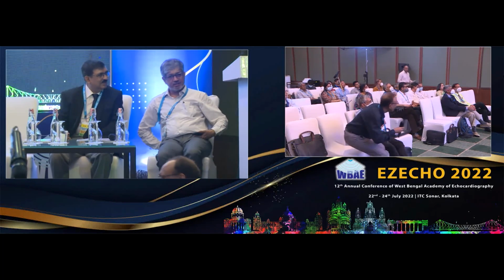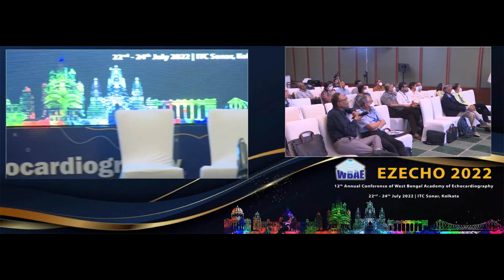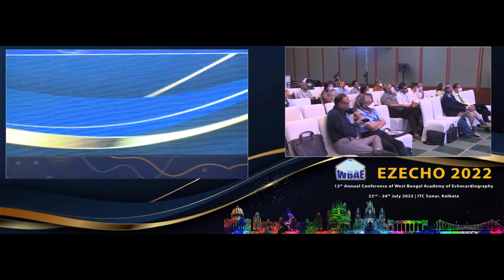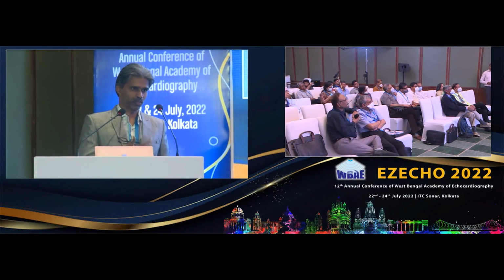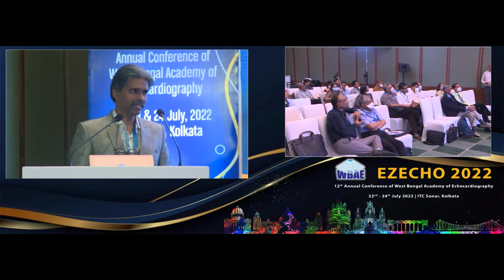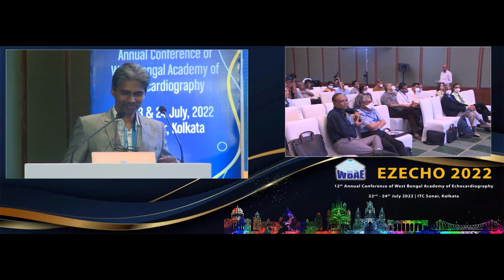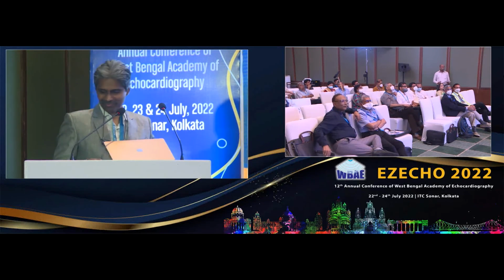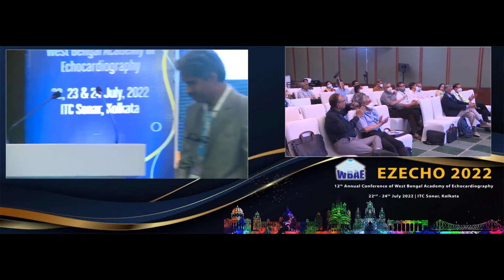Yeah, maybe in future those things may be possible. Anyway, currently the major problem with the open MRIs is that they are low Tesla systems. So you need a superconducting magnet, like at least 1.5 Tesla, to do a cardiac MRI. Okay. Thank you.